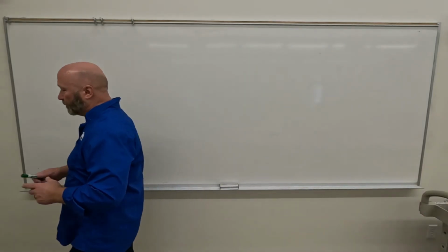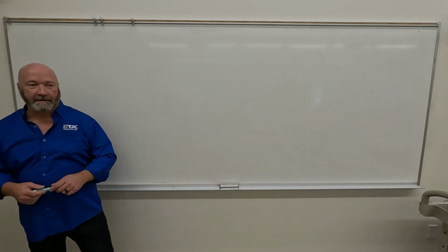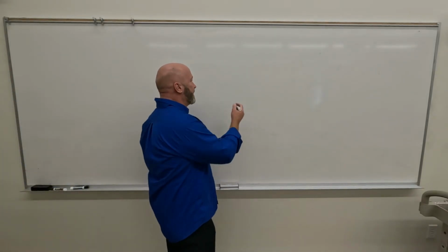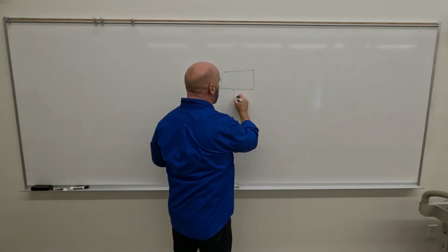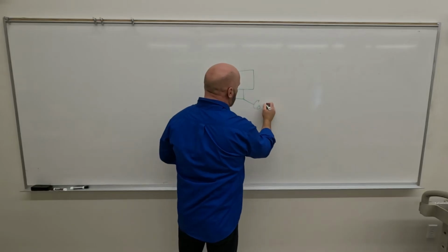All right, so protective housing is what you normally look at and you think X-ray tube. So the protective housing is that thing that's directly above the collimator housing.